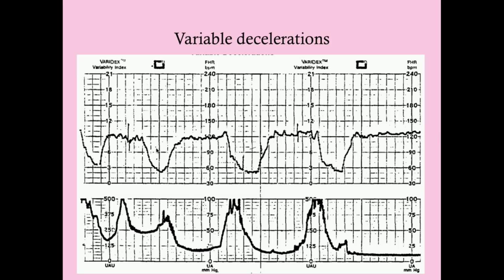Okay, now if you didn't have these, let's say you only dropped a little bit, and you had early decelerations, for instance, that were coinciding with these contractions, then in that case it would be reassuring. Okay, because early decelerations are not uncommon, they're not non-reassuring, they're inconsequential. But these are severe variable decelerations. Now, you might confuse it with a late deceleration. And let's look at late decelerations.